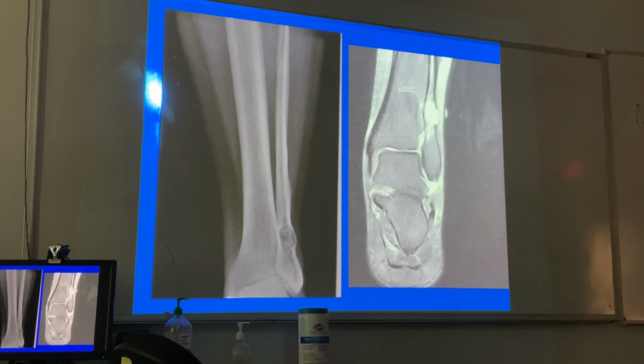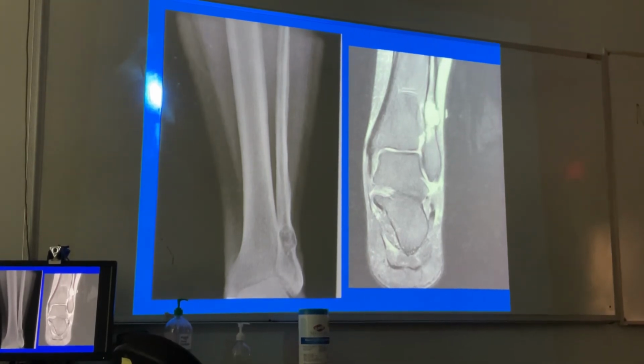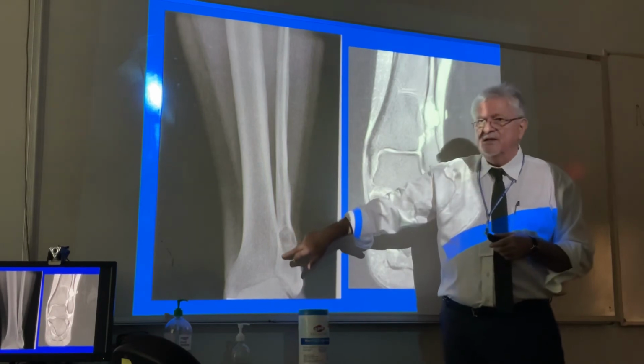He's going to clean this out, but he also has to appreciate there's this. If he doesn't clean this out, there's a recurrence rate that happens with incomplete excisions. Now that's their end. I'm just saying, plain film, this is how National Board Part 3 is for you. Plain film, make a decision.